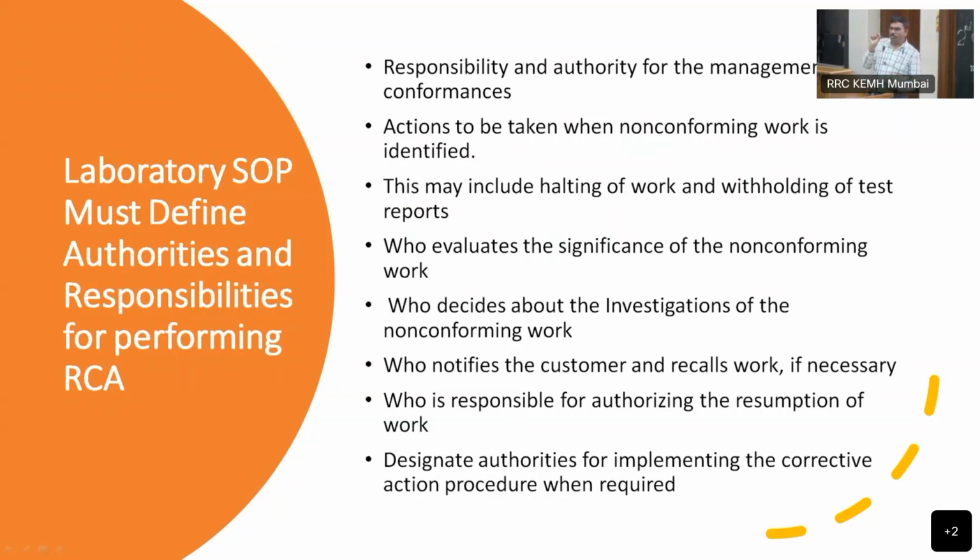So method contains what? How much sample is need to be picked up or injected, how much time it will run, to which column it will run, and what are the conditions, what is the detector characteristics, and what UV or visible filter paper it has to measure the hemoglobin, right? That is the method we have to load. And he has given the command of 20 samples with controls and all those things. And walk out. Okay.